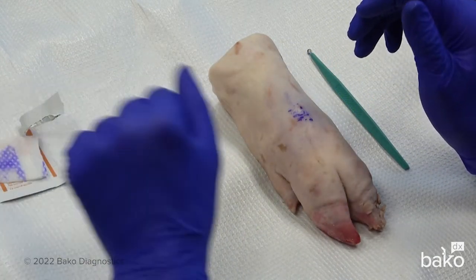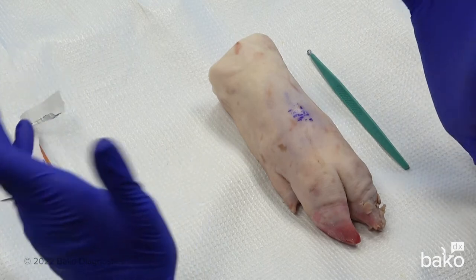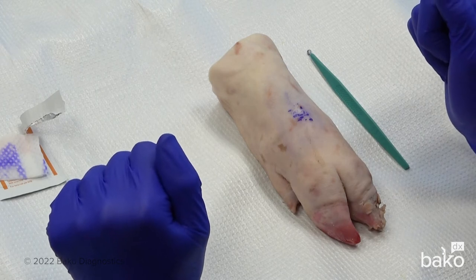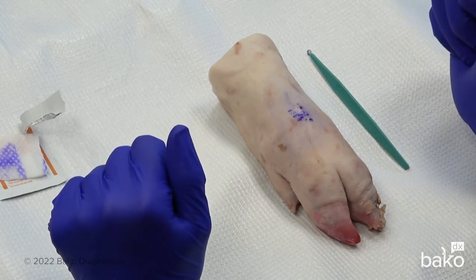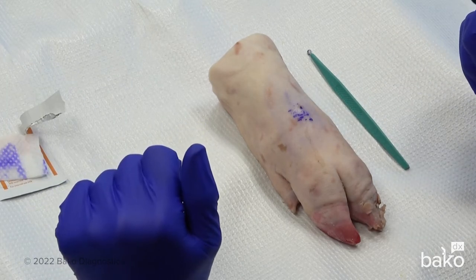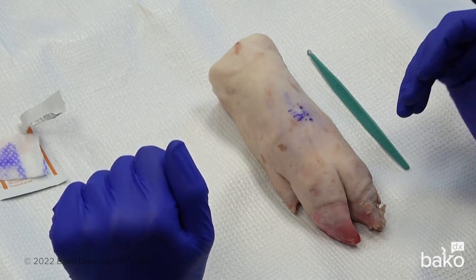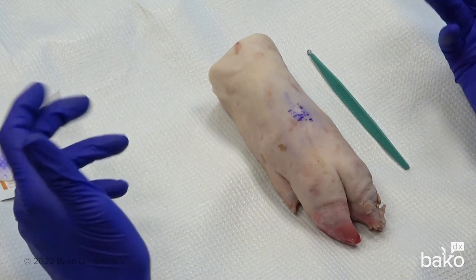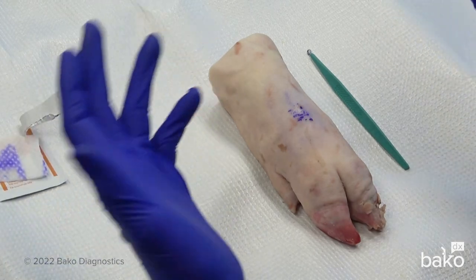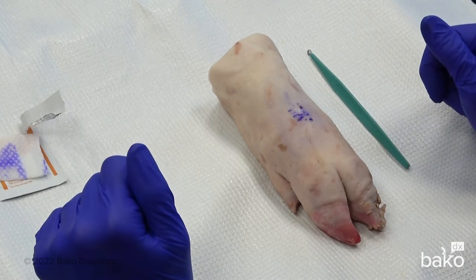The pros of this procedure are that anesthesia may or may not be required, and it's minimally invasive. However, it does have limitations on diagnosis. In cases of dermatitis, it can certainly identify whether fungal elements are present. However, because the dermis is not present, you won't be able to tell much about any inflammatory process that's occurring. With neoplastic lesions, this may give us an idea of whether it's a squamous cell carcinoma or a verruca, but if it's a squamous cell carcinoma, we may be limited in what we can tell as far as an invasive component, because this procedure is not going to preserve orientation of the tissue within the body.